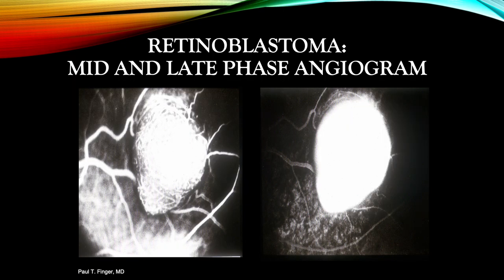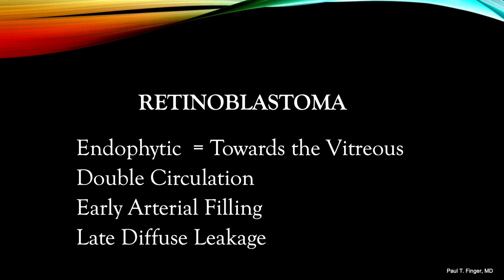In the mid-phase fluorescein angiogram, we see the tumor vessels start to be obscured by interstitial leakage of dye. In the late phase, there is a light bulb-like appearance with no discernible tumor blood vessels, and fluorescein can be seen leaking into the overlying vitreous. In summary, endophytic retinoblastomas extend into the vitreous and are not covered by the RPE; therefore, early phases of the angiogram demonstrate both tumor blood vessels and overlying retinal vasculature — called a double circulation. Late phases reveal a diffuse glow due to interstitial leakage, even into the vitreous. The early phases are the most important.